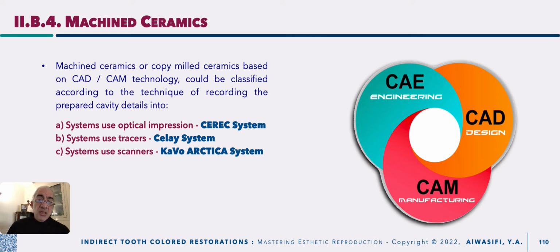Then comes systems used tracers, which is the Celay system, but the Celay system actually is not a digital one. It just only describes how you could transmit your picture or your anatomy. It is not a picture, it is how to transmit anatomy by a tracer to the milling machine. It is still considered as a machined restoration, but it is not digital.